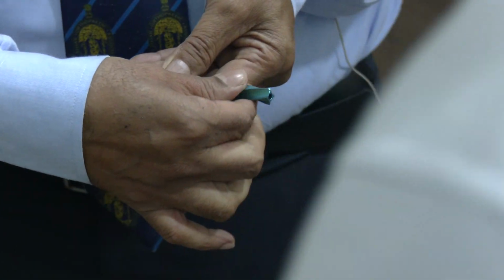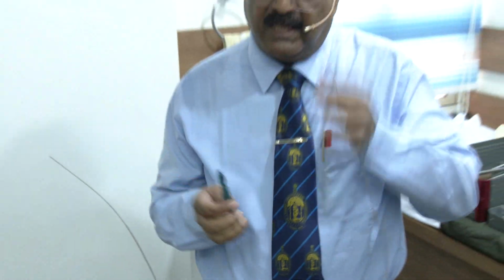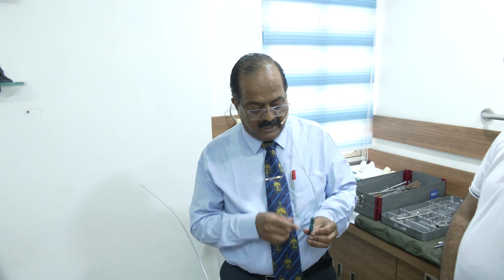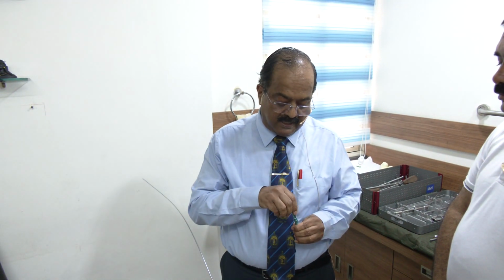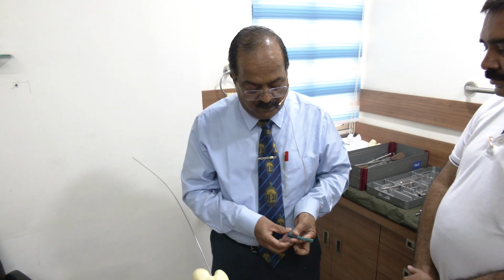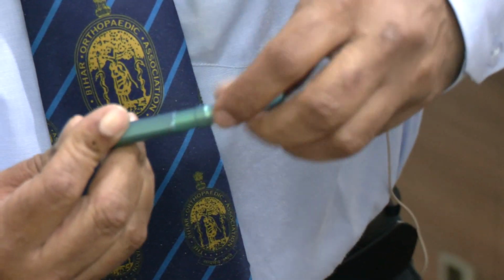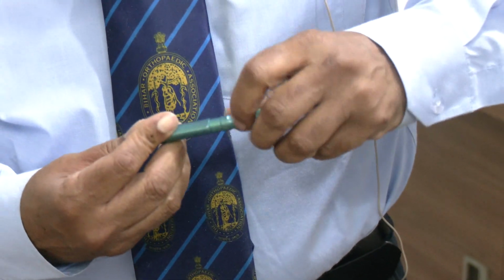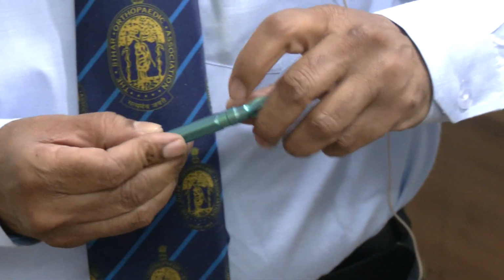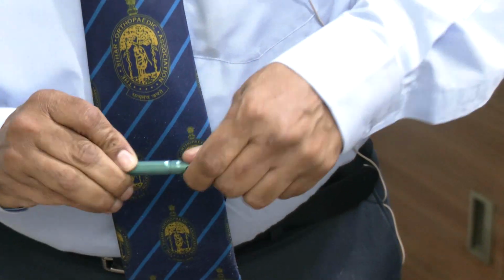So this is a very, very important step. This is the commonest mistake every surgeon makes. It's not the surgeon, it's due to the OT assistant. Since you are all involved with the implant and the instrumentation supply, I'm making this point. Always see that nobody keeps on playing with this blade while you are giving it to the surgeon. So use only open. See, now it is not possible to lock it because it has come out totally, so it is sometimes not possible to lock it back in position. So never open it up without the instrumentation. That's what I want to emphasize here.